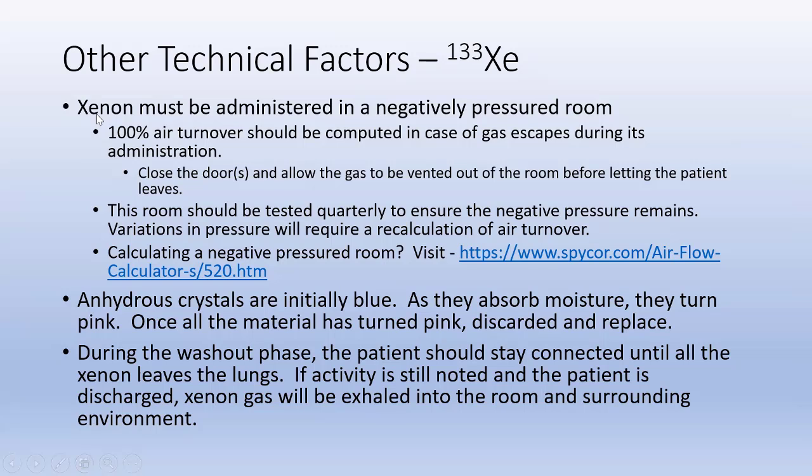Why? If the patient rips off their mask and says, I can't breathe, when they exhale, xenon's flying through the room. You need to close that door. You need to make sure the ventilation system is working. You need to let that gas escape. How long does that take? That's something that you need to determine.